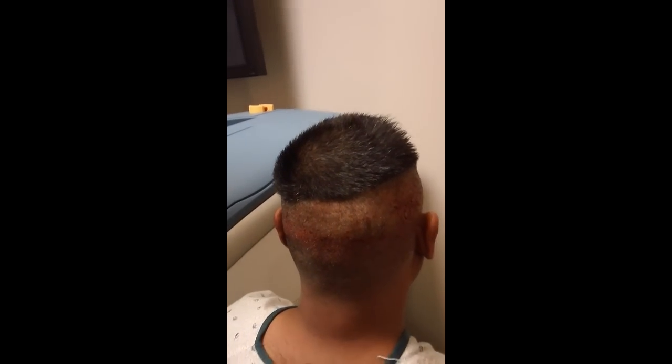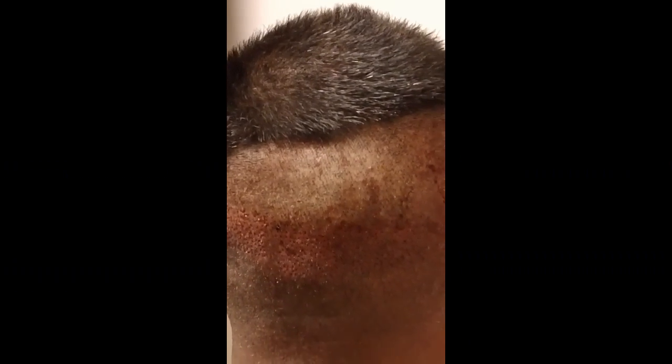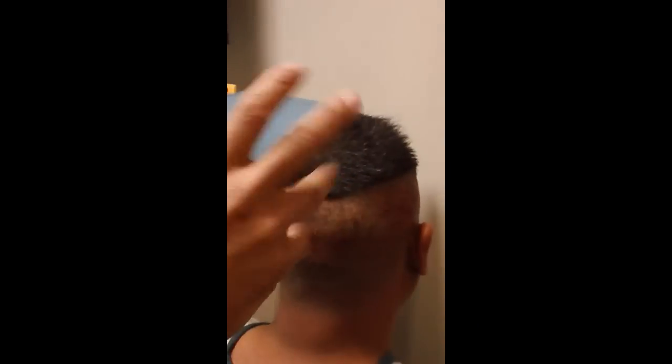The holes are small. They look comparable to the FUE sites that I used before, which is a 0.9, but in actuality they're about a 1.2, but once it heals it looks pretty good.